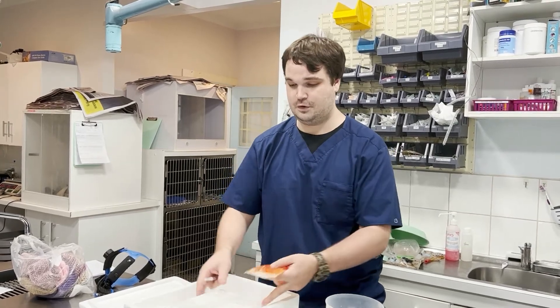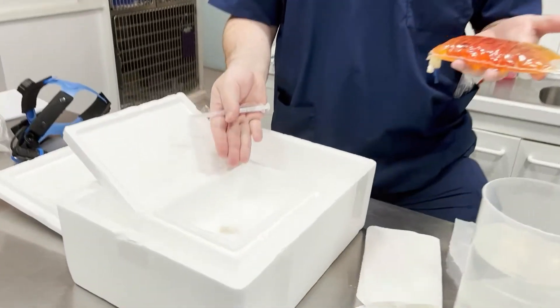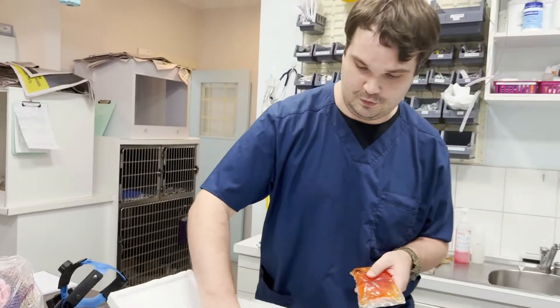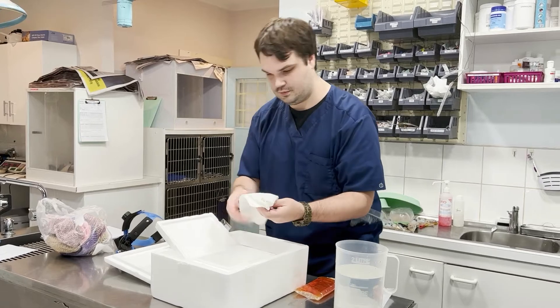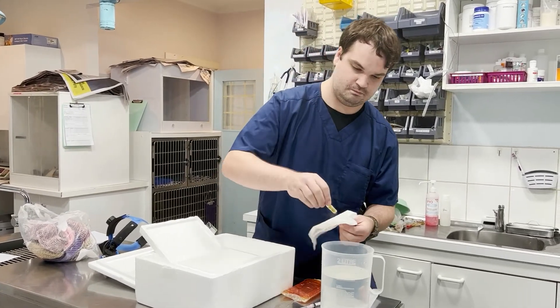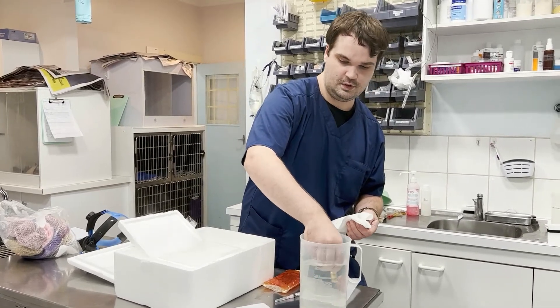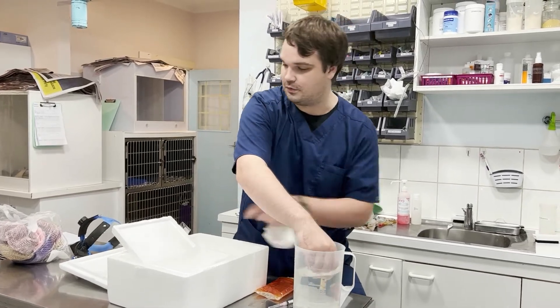It comes frozen on dry ice. This is a diluent, and in here we have the actual vaccination itself, which is concentrated and frozen on dry ice. We need to thaw this out in 28-degree water very quickly, within 60 seconds, without freezing my own finger off, because that is quite cold.